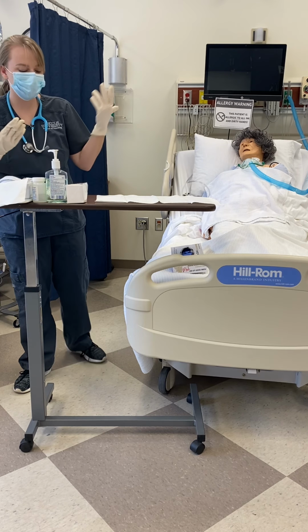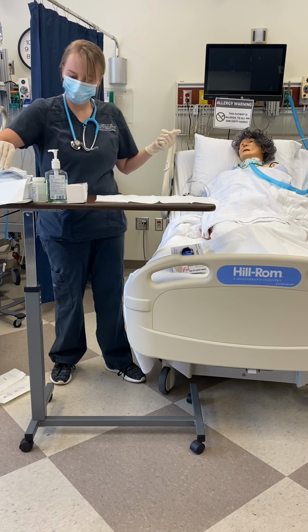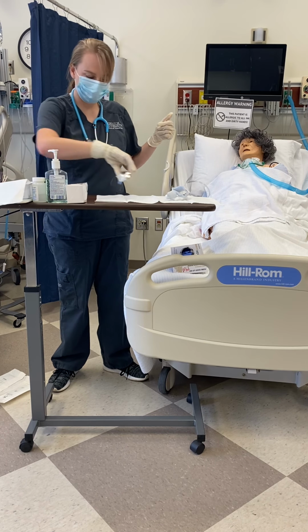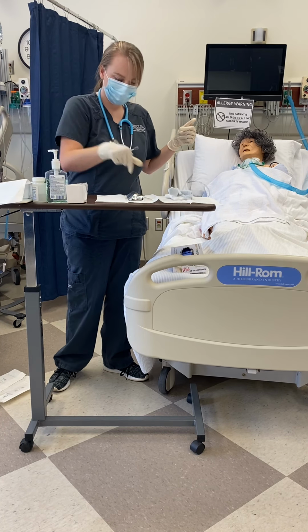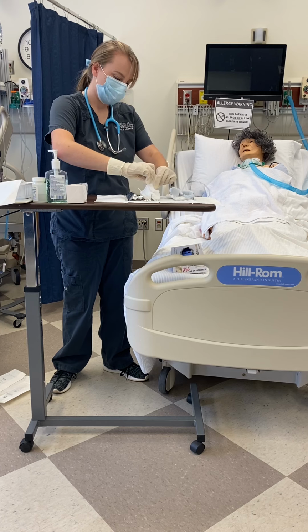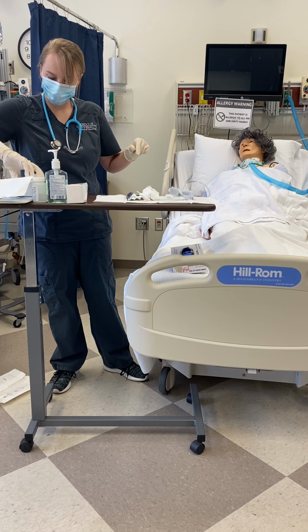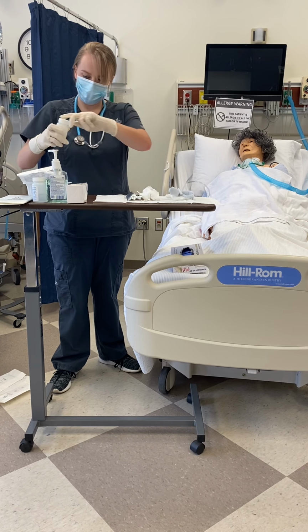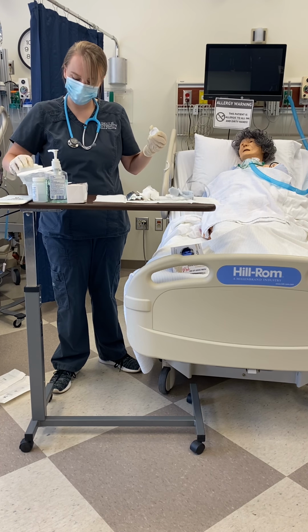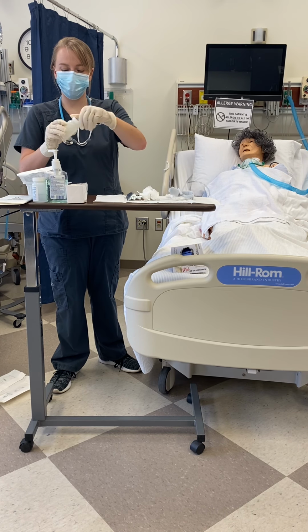That glove rolled again, so I would have changed it. And now I can set up my stuff. I will put saline in both compartments. Sterile saline in both compartments.